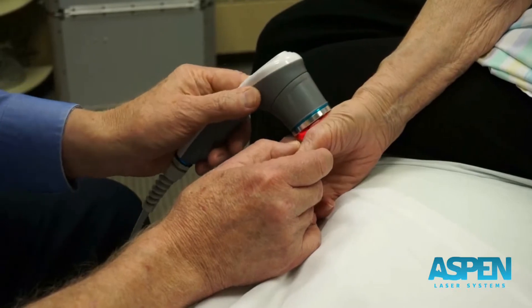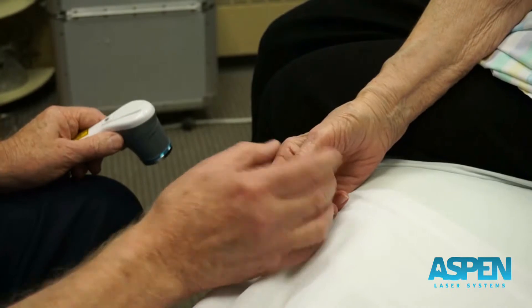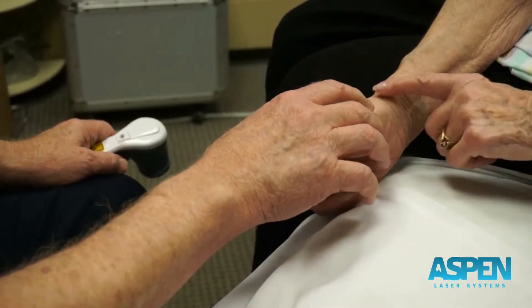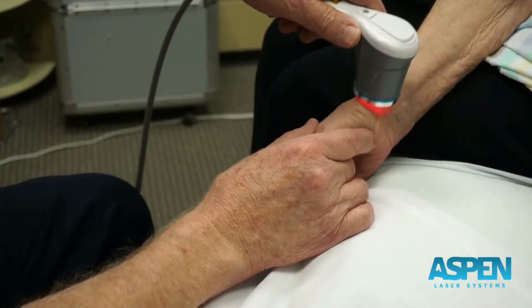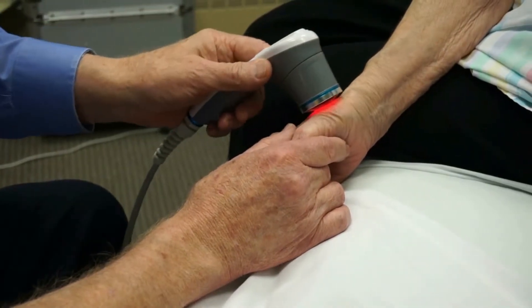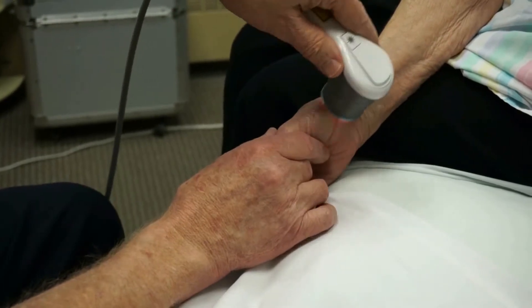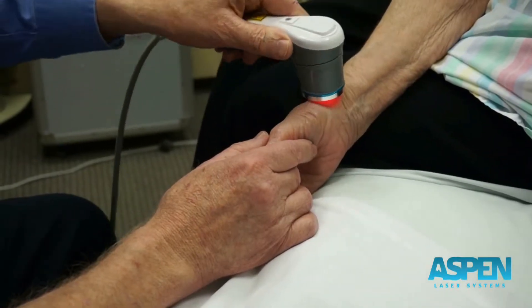So you kind of differentiate out different areas and focus more down on where the pain is actually coming from. A lot of times I may stop, ask the patient to push against me, tell me where it hurts — 'hurts right there, okay, that's where we want to focus.' Then we'll come back in a little bit, take a different angle, do the same thing. So we're using manual resistance to help us dictate where our therapy is to go.